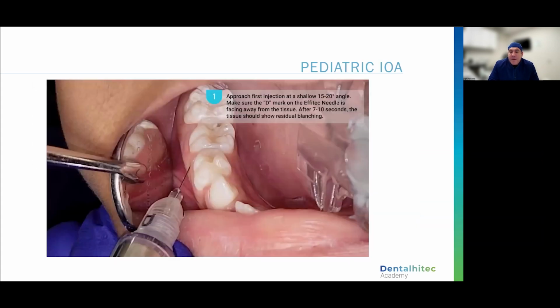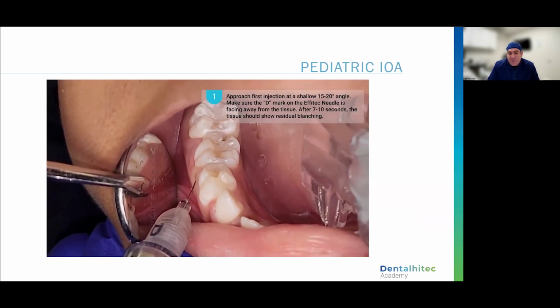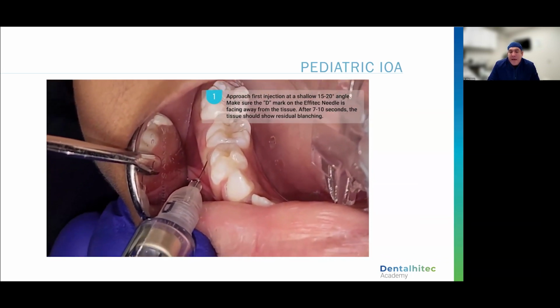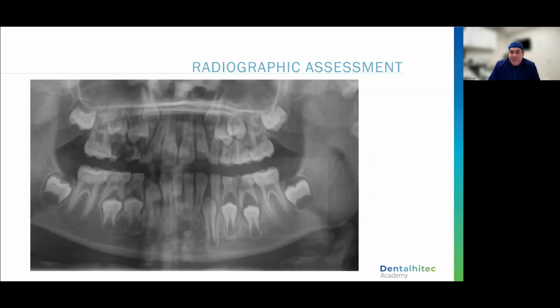All right. Angulation matters. I love this video. It's available on the NuSmile recorded webinars as well. But remember that you want to have your finger position slightly different here.